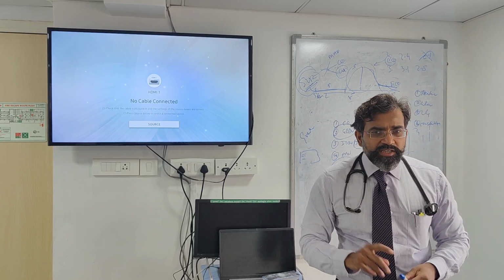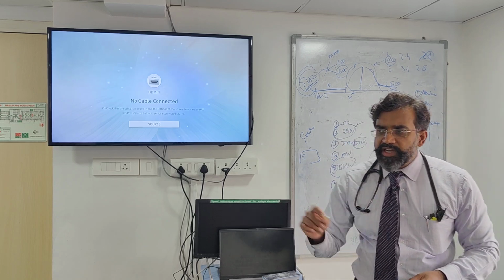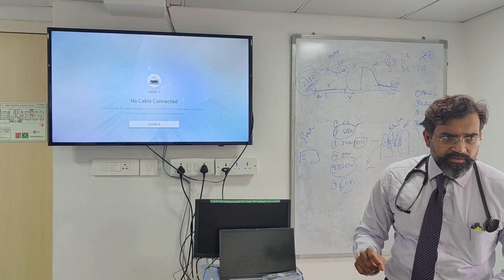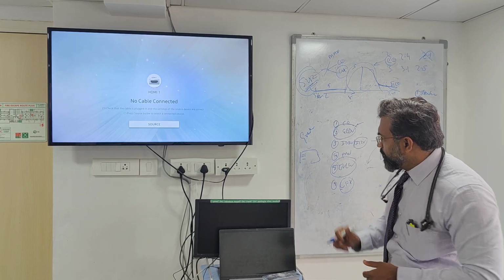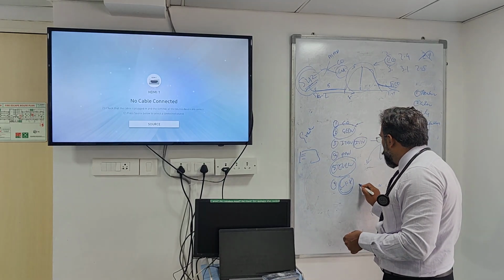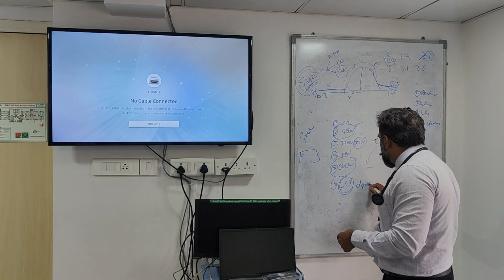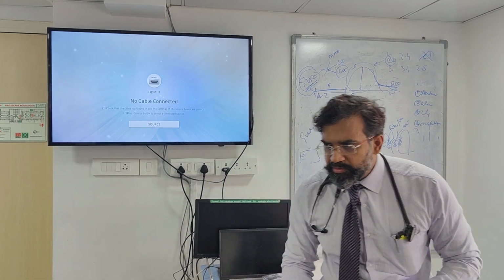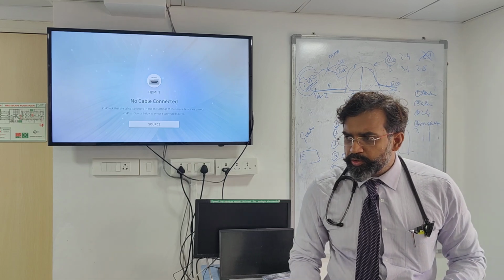However, it's not as accurate as GEDV or extravascular lung water. It's not as accurate because it is taking CFI from something called dP max. So if you were to open that value, there will be dP max on it. Can you see dP max on it? Open karke dekho.